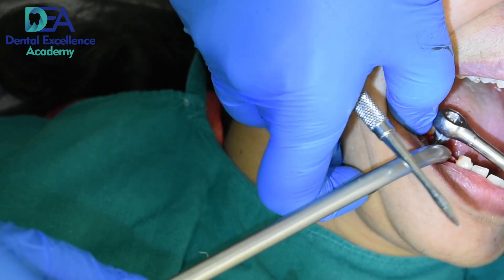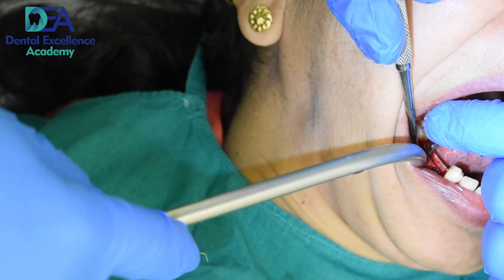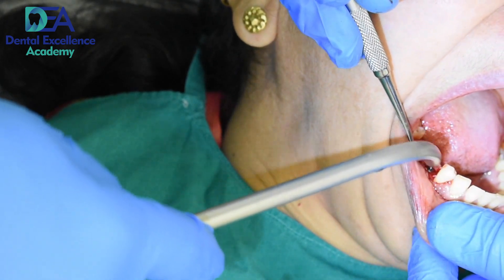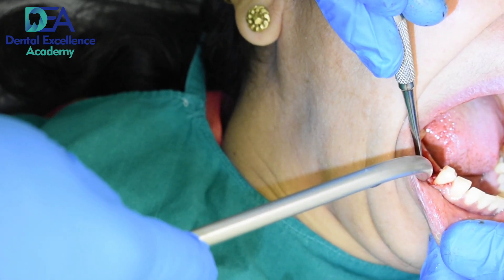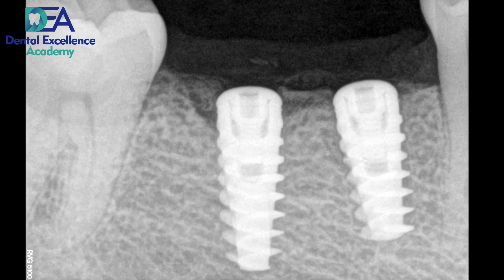Try to go at least 1 mm subcrestal, as that much bone loss can be expected over a period of time. But if your prosthesis is good, there will not be any bone loss. This is the post-op radiograph — we are almost equicrestal, parallel to each other and to the adjacent teeth.